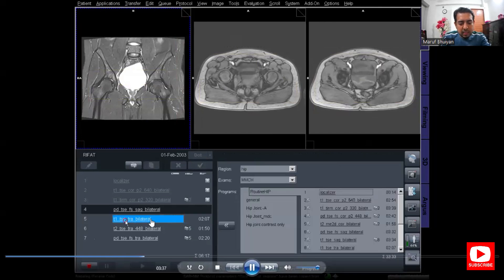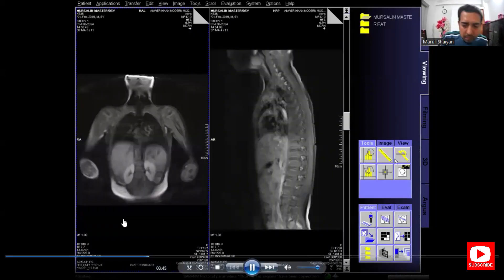After planning, click Apply. As you plan the T1 axial, the other two axial protocols will automatically copy the plan from the T1 axial planning.